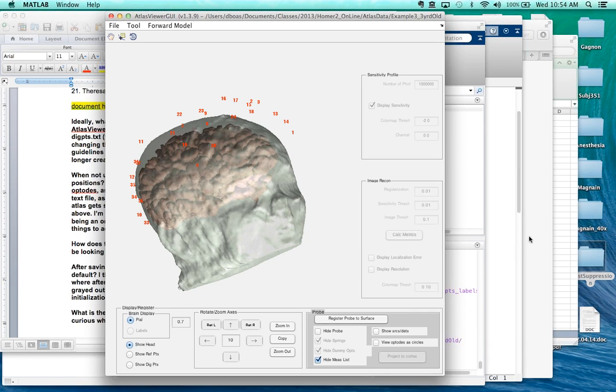I had a question along those same lines. Yep. Go ahead. Is it the case that you have to convert from the .ezs files to a digpoint text file? And is there another way of creating that text file without using the EasyMapper? Yeah, that absolutely. EasyMapper was a tool that Chin Fang developed, but I think only about 3 people use it.